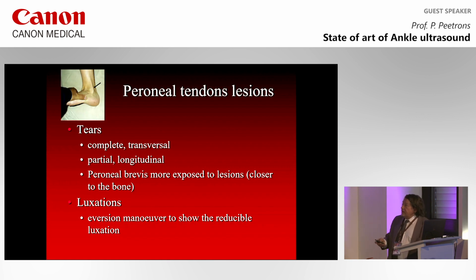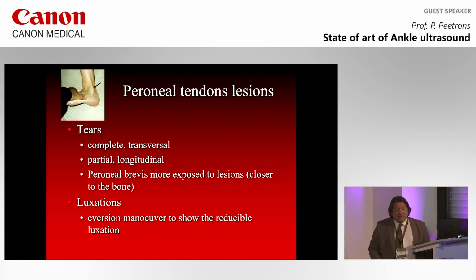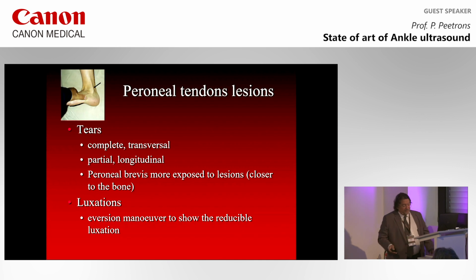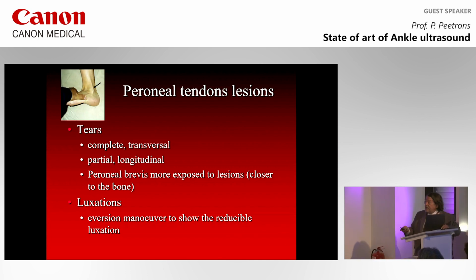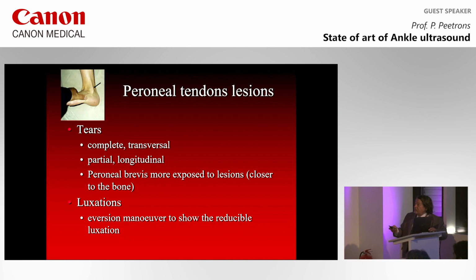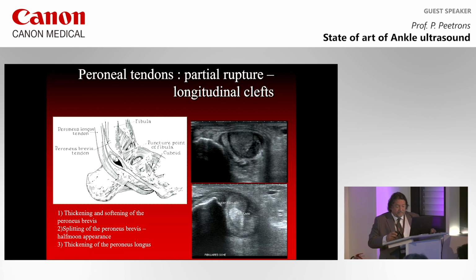The eversion maneuver is this. You ask the patient to dorsiflex the foot and then to pronate the foot towards the lateral part, and you push a little bit with your thumb on the foot. This is the eversion maneuver to see reducible or irreducible luxations of the peroneal tendons.